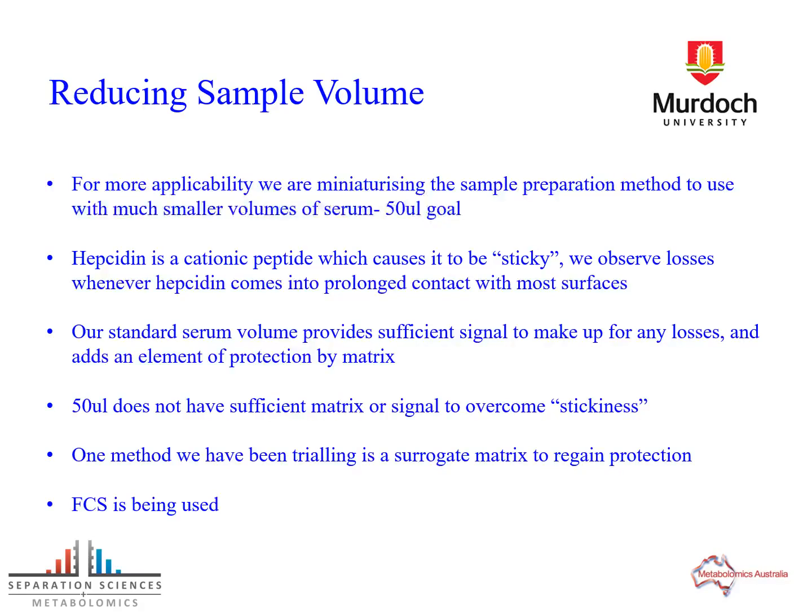Part of that challenge as we reduce the volume of serum or plasma is that hepcidin is a cationic peptide, and it's quite sticky, and it's well described in literature that losses do occur because of its stickiness. So as we leave things sitting around over long periods of time, we certainly see reduction or losses of hepcidin associated with that sticky nature. In general, if we process everything in a timely manner, then there's sufficient matrix to provide protection so that we can address those losses.